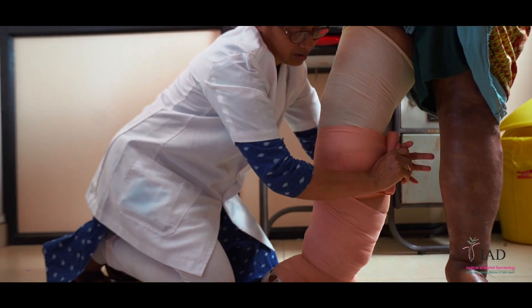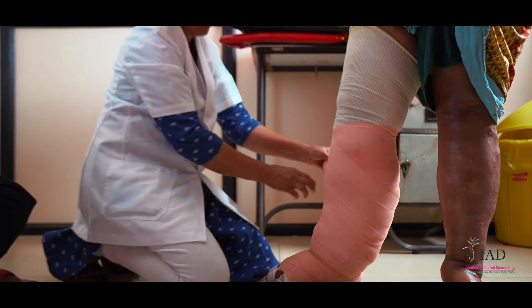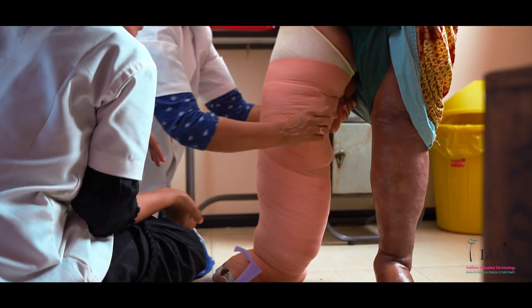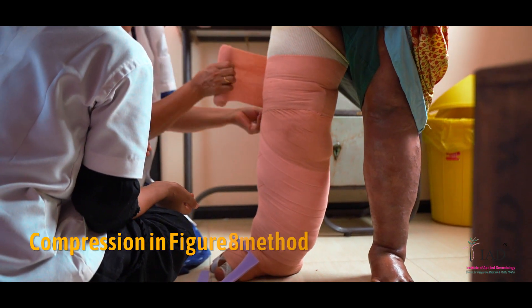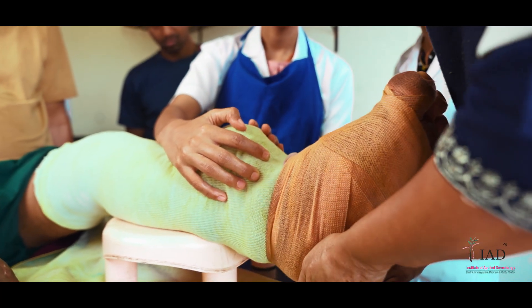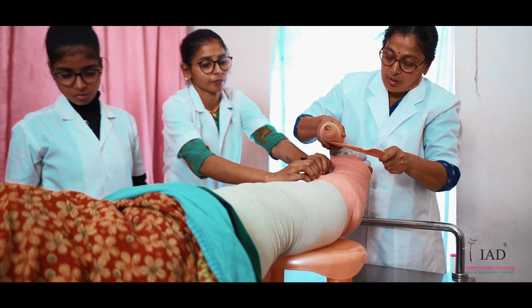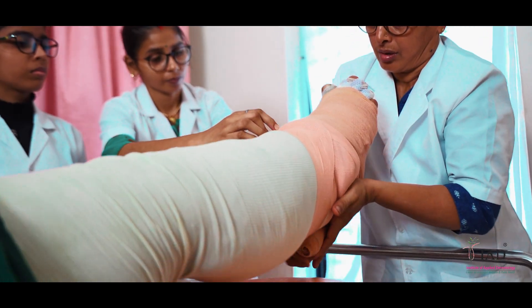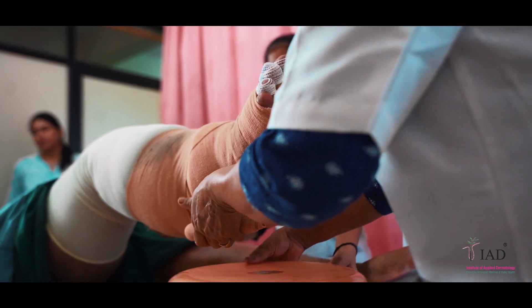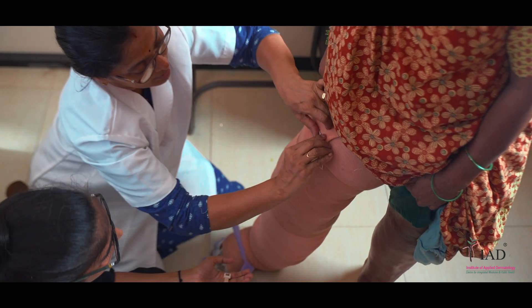Then tie compression bandages from foot till knee or up to the groin according to the extent of edema. Make sure that compression bandaging is always done in the upward direction, i.e., from foot upwards. Those who have more swelling over the foot, bandages of 8 cm or 10 cm wide can be used. Apply more pressure over the foot and reduce the pressure while moving up. Pressure over the thigh should be less compared to the lower part. Finally, secure the bandage with the clip anteriorly.